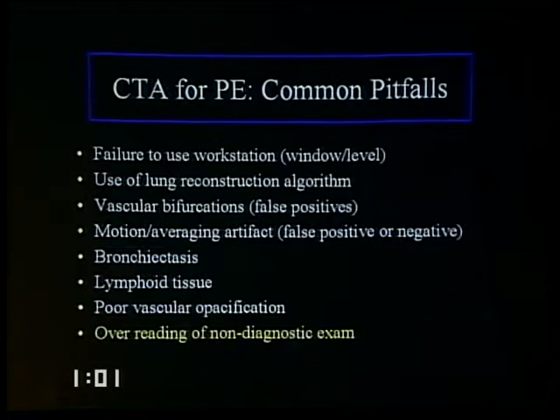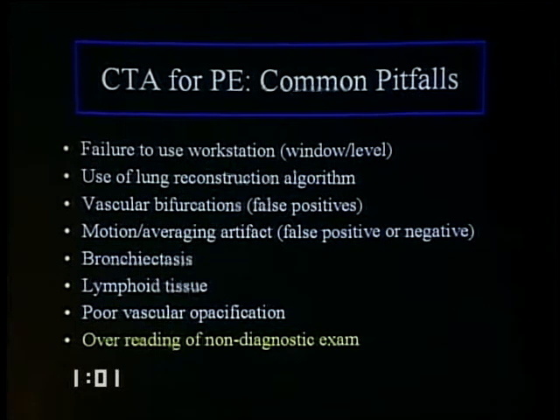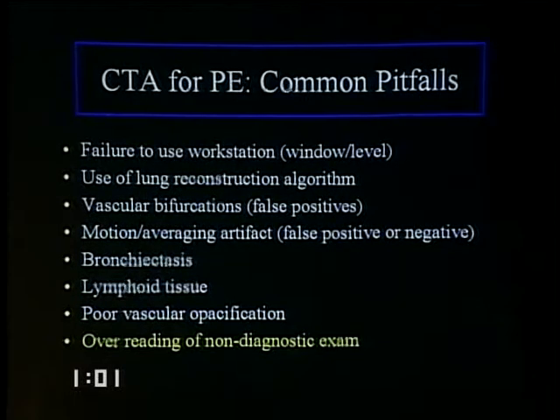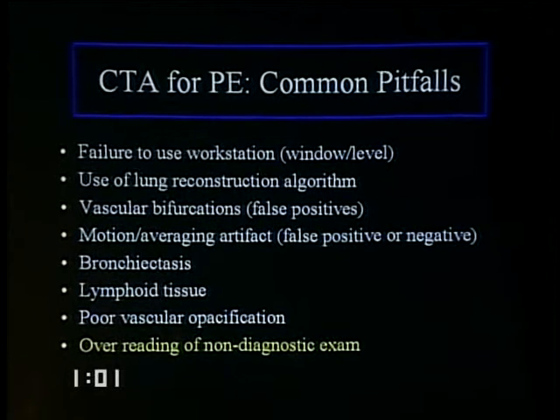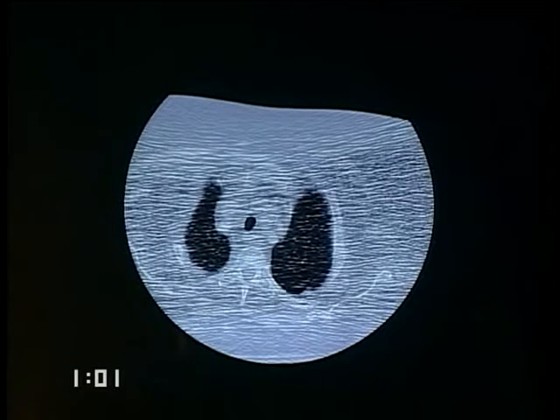My tendency now is to stick with a thin collimation and try to read through the noise. And there's a temptation to overread a non-diagnostic exam to say something like it's grossly normal. And I strongly recommend against that policy, because in that situation your exams are no longer very reliable. We try and draw a line between what's diagnostic and non-diagnostic. If it's non-diagnostic, the clinician can decide to do a scan, to do an angiogram, depending on their level of suspicion. If you say it's grossly normal, it will tend to be translated into a negative scan by the time it gets to the chart or the attending physician. So we have to be a little careful.